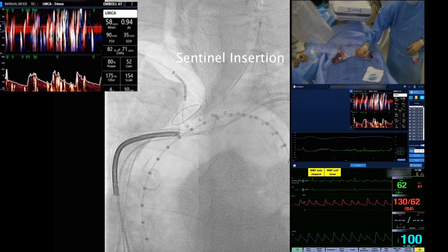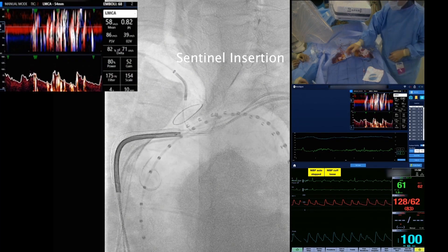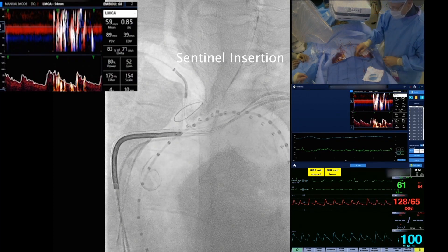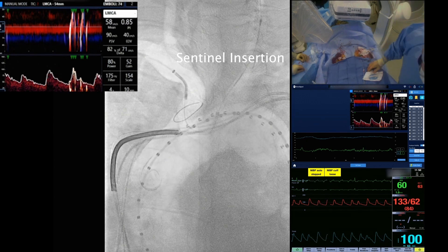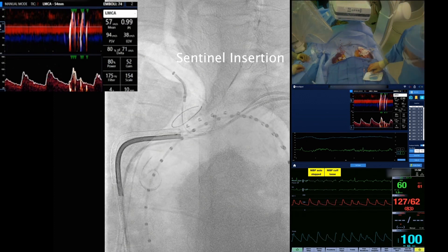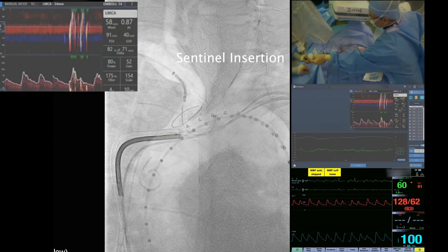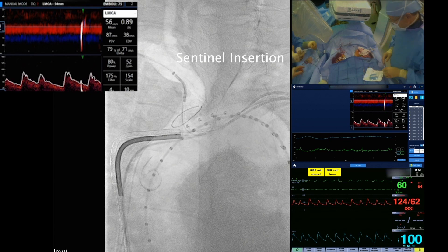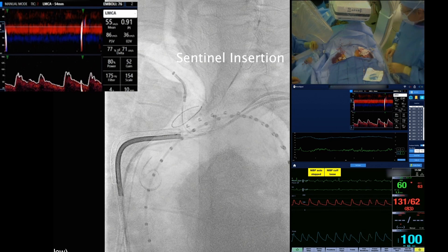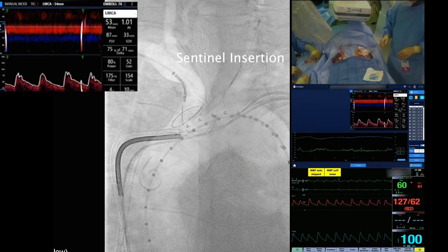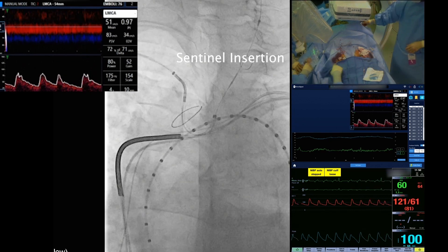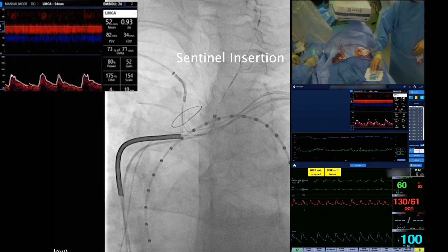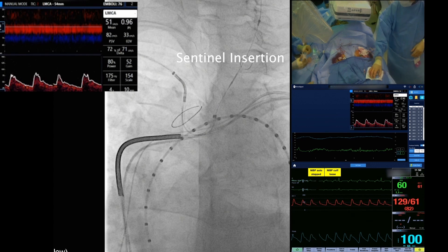After performing the TAVR, the Sentinel device is retracted by resheathing the distal filter, then retroflexing the catheter, and finally resheathing the proximal filter. The device is then retracted over a wire.